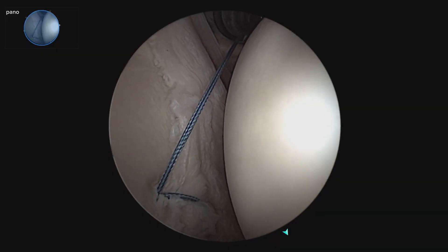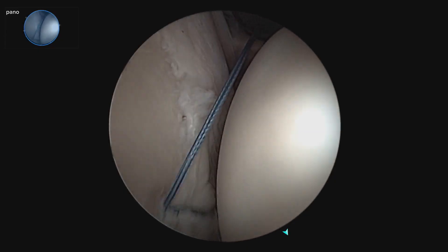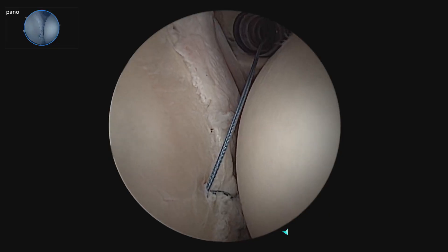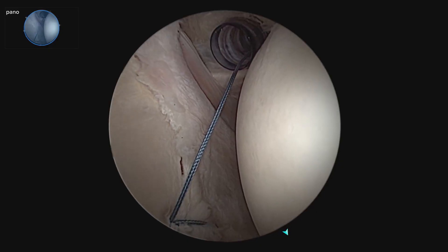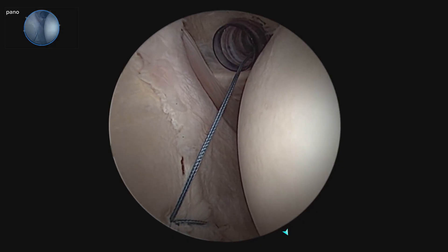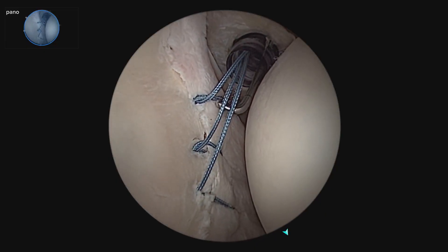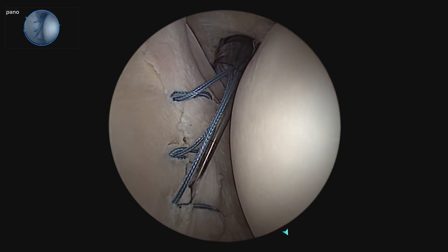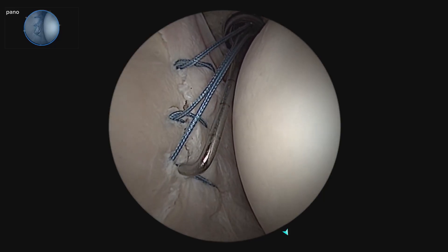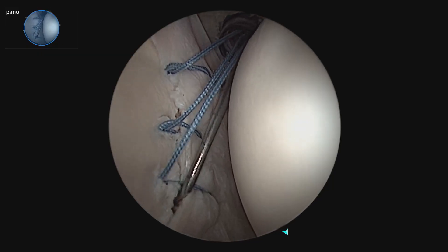We will put in a few more anchors to finish this Bankart repair, leaving the tails long for final tensioning at the end. Once they are all done, we will leave them out of our anterior portal, leaving our nano working cannula free for fluid management later on. We kept the labral repair loose so we can still move the labrum, allowing visualization in the back of the shoulder for the remplissage without overstressing our repair.